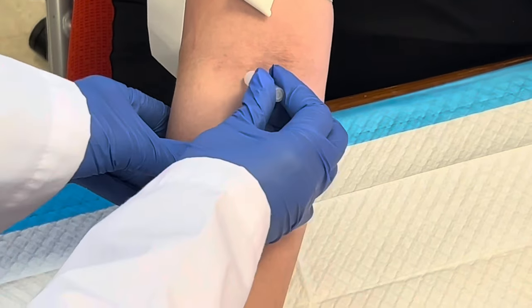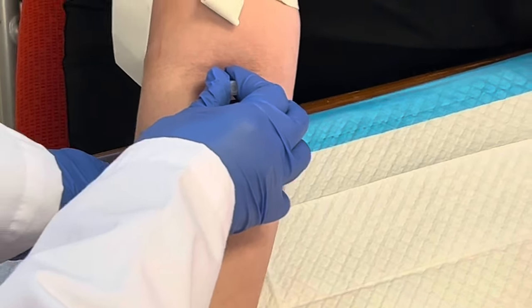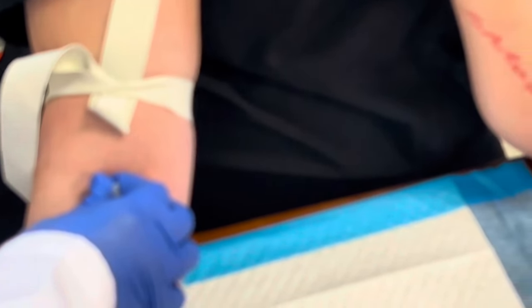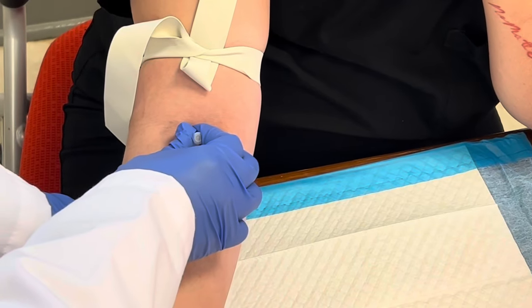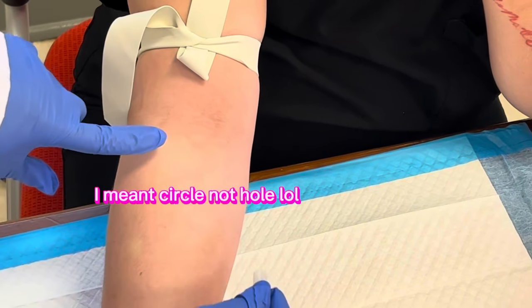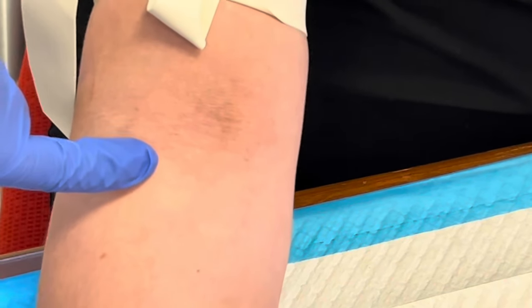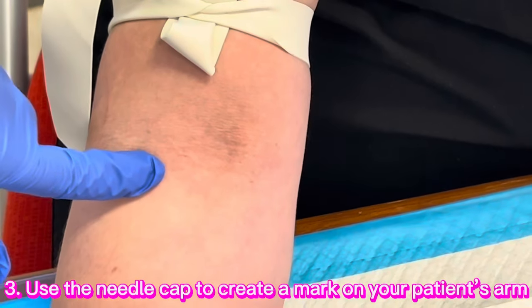So what I'm going to do, I'm going to take this cap and I'm going to press it into her arm. I'm going to press it into her arm just for a few seconds, and then that's going to create a little mark so I'll know exactly where I'm going.